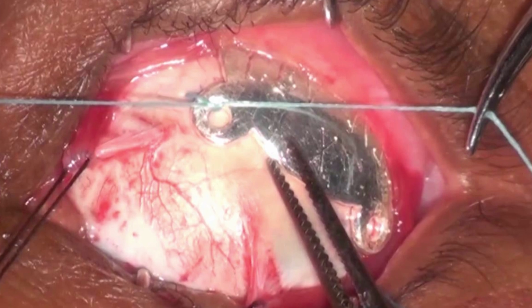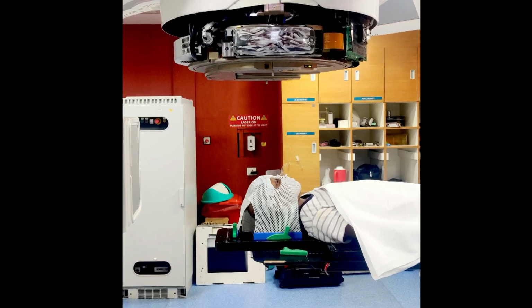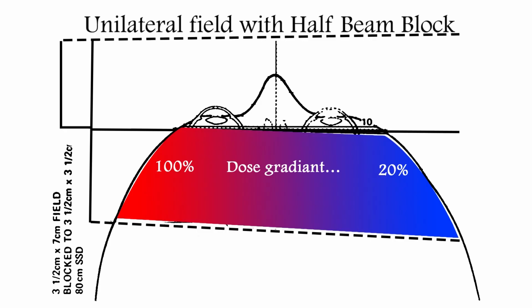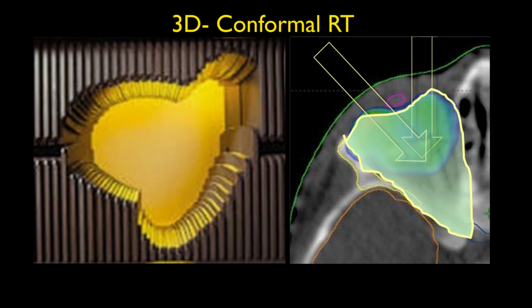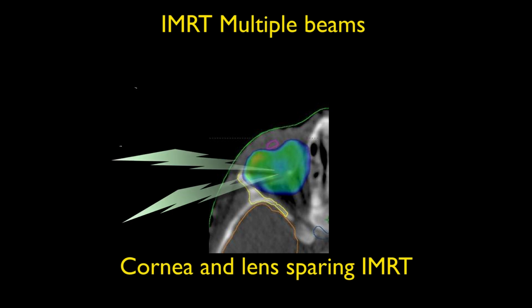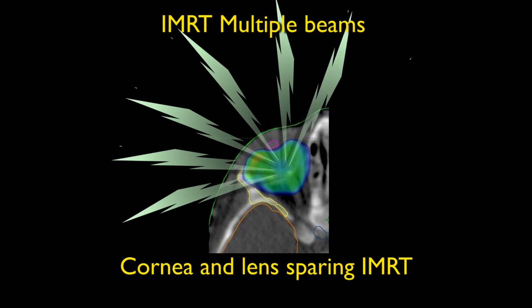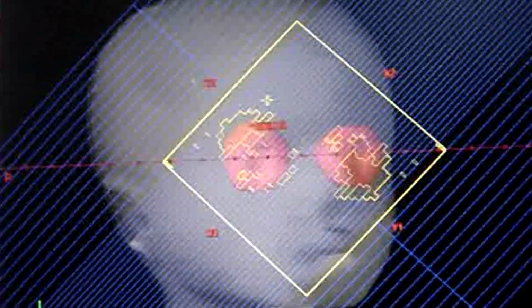the target tissue. External beam radiotherapy or EBRT or teletherapy has evolved significantly over the last few years, starting from 2D EBRT, 3D conformal EBRT, intensity modulated RT or IMRT, wherein each field is subdivided into numerous beamlets whose intensities are individually modulated to achieve a non-uniform dose distribution from each field. In rapid arc modification of IMRT, dose painting is achieved with opening and closing of multi-leaf collimators.